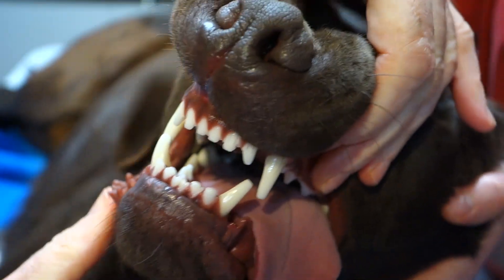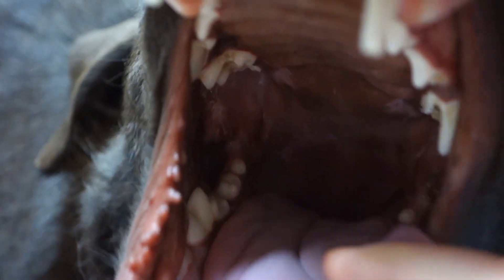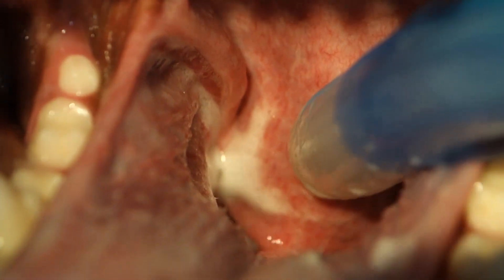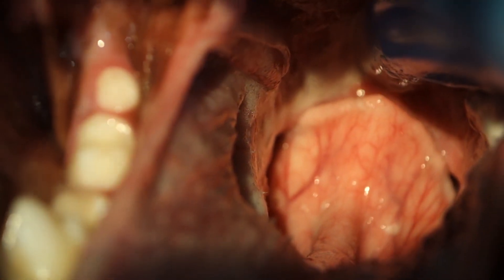He's got a very heavy head. Get his lips up out of the way, and then I'll pull the lower jaw down. We'll use a laryngoscope to make it a little bit easier so that we can actually see what we're looking for. Pull the tongue out straight between the canines. Now we can see right at the back of his tongue — we have the soft palate there. If we pull the soft palate, you can hear him snoring; that's wobbling that pink flesh. That's like a big curtain of pink flesh. If I push that up and back, then you can see the epiglottis.